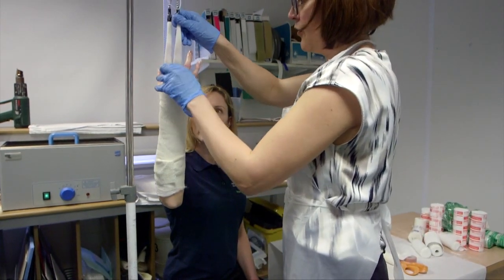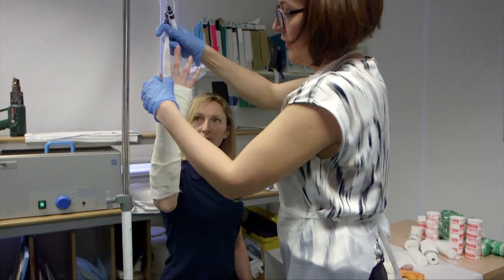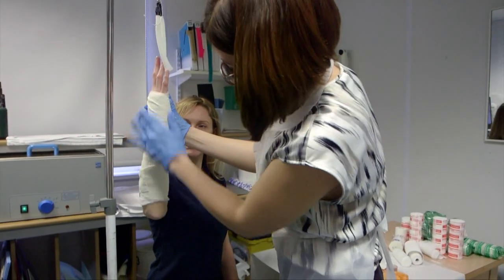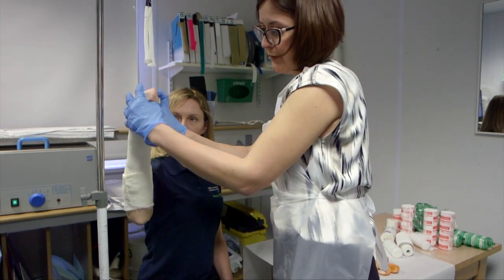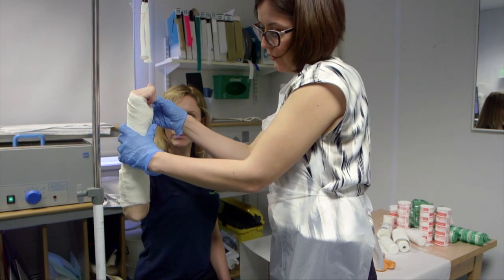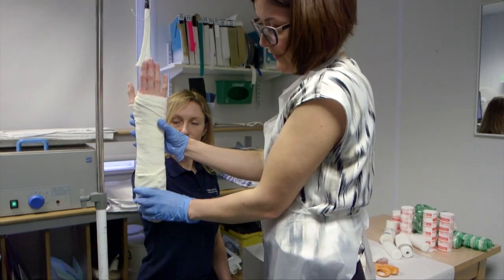The finger traps are removed by gently compressing the loops. We check the backslab — you can see neutral alignment, no ulnar or radial deviation, and coming around to the volar aspect, the MCPJs are completely free so that you can allow 90-degree flexion. Likewise, the thumb is able to move. This is how the backslab should look when finished.